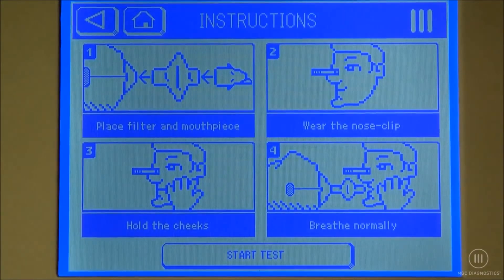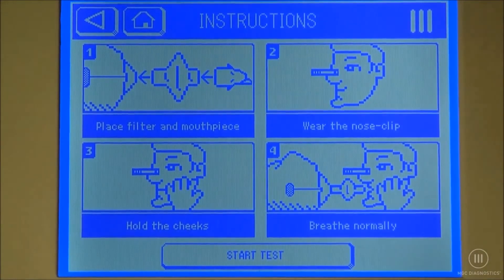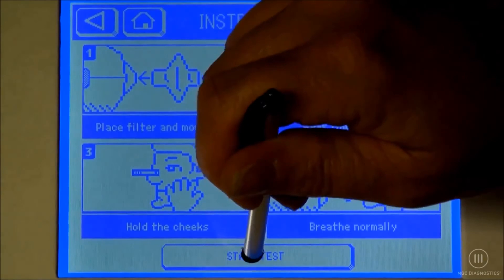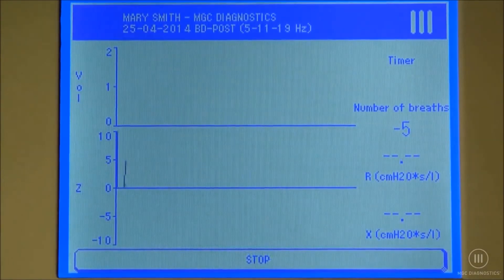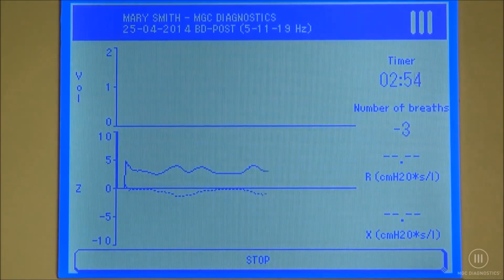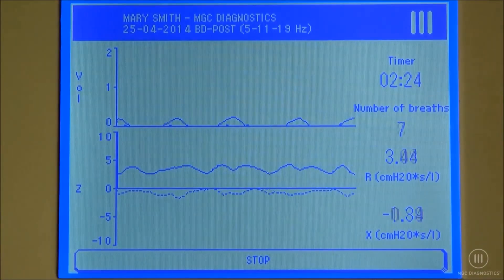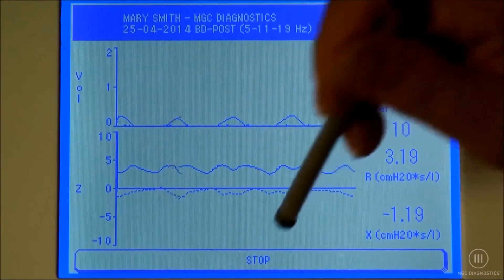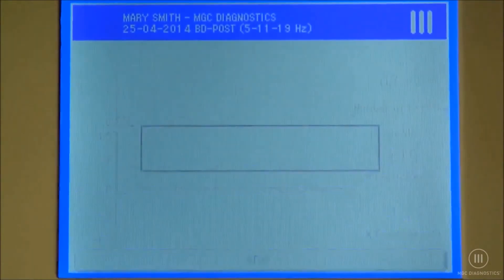We're going to have our patient attached to the FOT device, nose clip on, hands on her cheeks, breathing normally. We're going to select start test. And ten. Go ahead and come off.